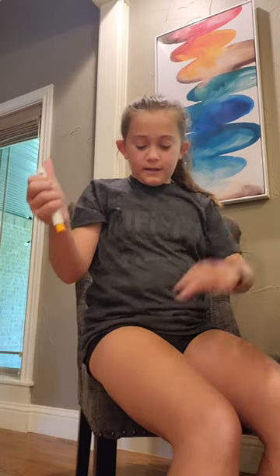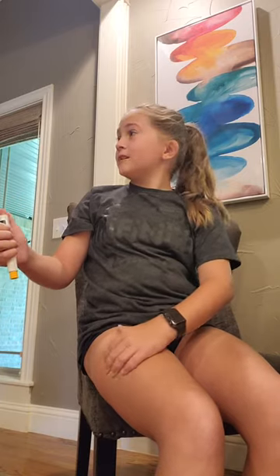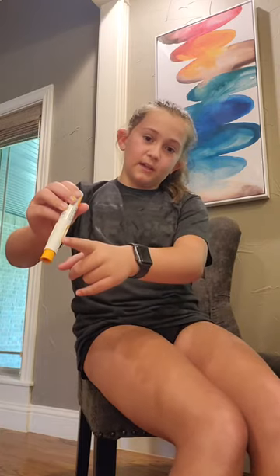Just to show you, I'm going to go about here doing my injection. There's a window right here, and you see this little orange part? There's a cap that you pull off — the cap's already off — and you'll place it on your thigh. Then you're going to push this orange part in. Then you're going to wait for this to turn yellow, and whenever it turns yellow you can pull it out. Wait like around three seconds to pull it out.